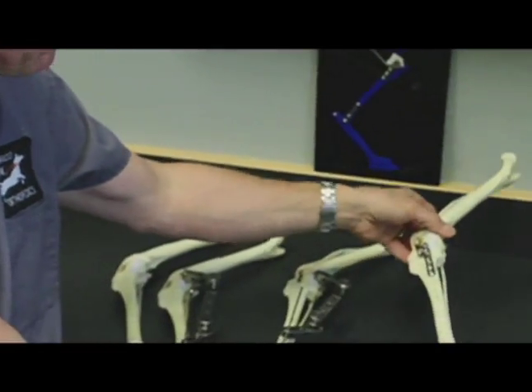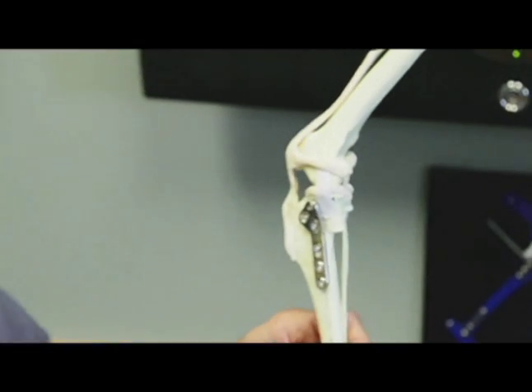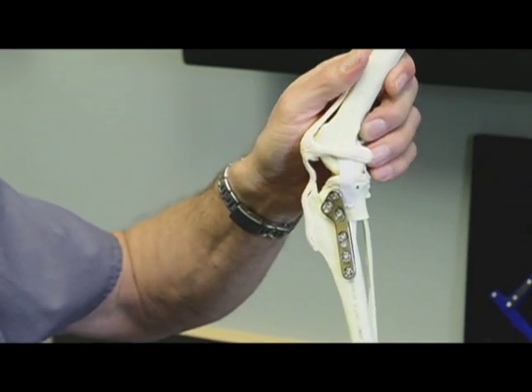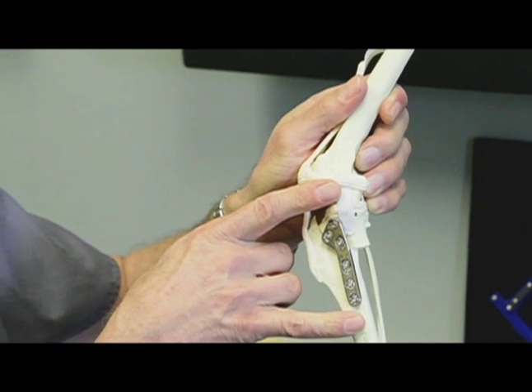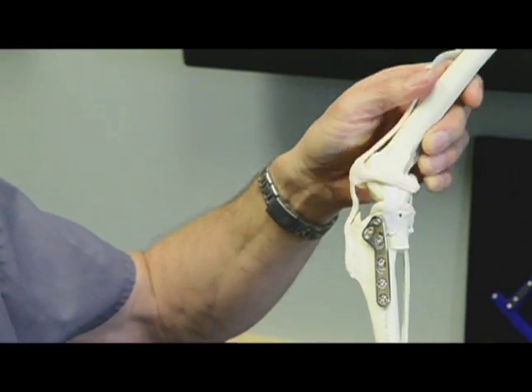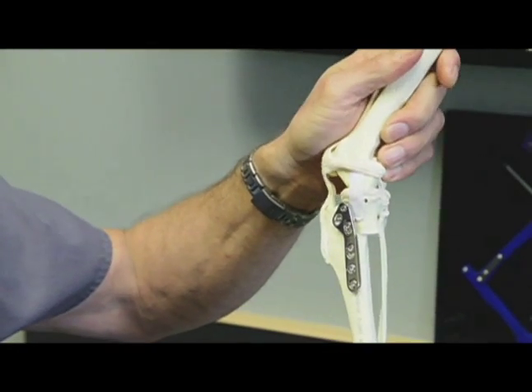And I have the final model that shows the plate in place with the rotated top segment, and that's what the final product looks like. We'd be looking at that much of it through the surgical approach. Once we're there, we test for joint stability and make sure that thrusting motion that we've illustrated before is gone, and then close the incision. The incision's closed with buried sutures that do not need removal. And from there, we move into X-ray and take a radiograph to make sure that the placement of the plate is correct and the tibial plateau's level.